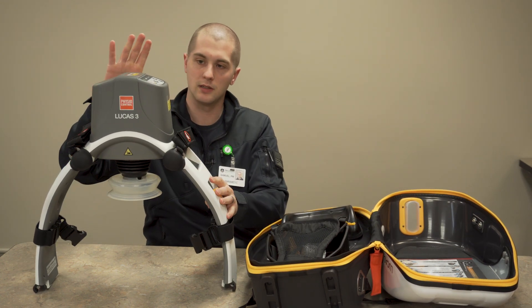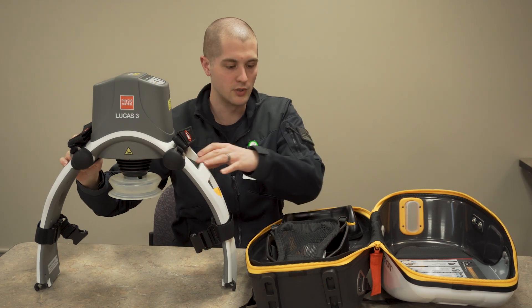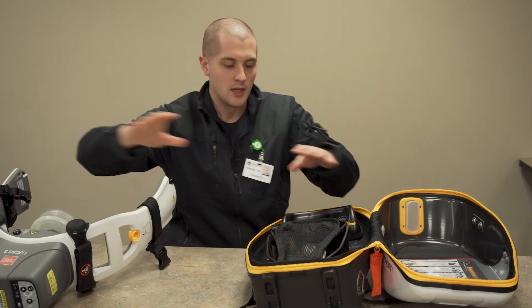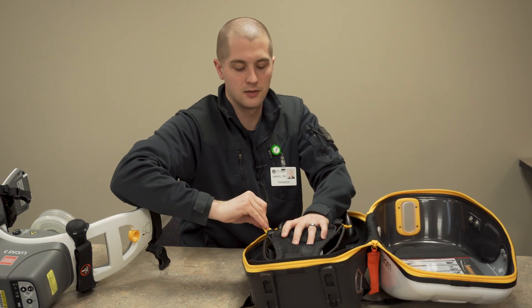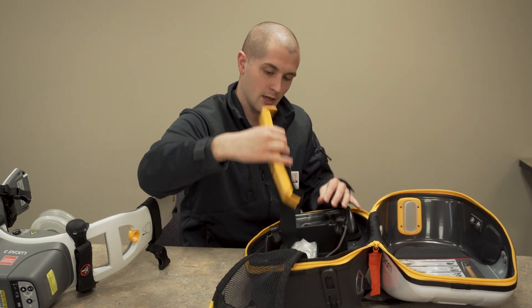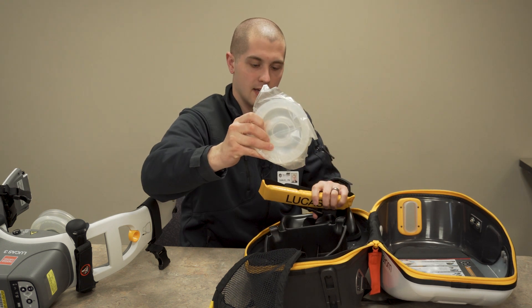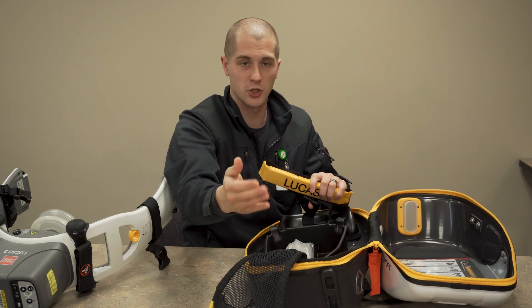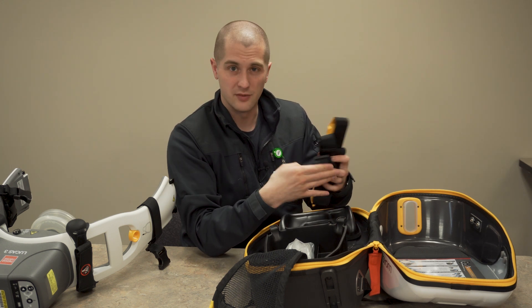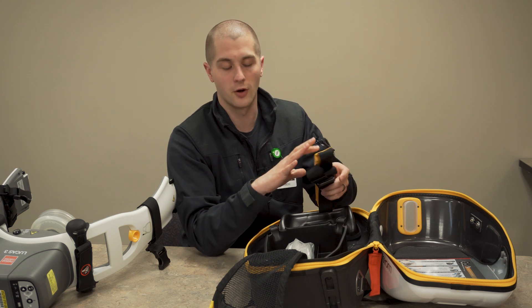The Lucas 3 system has several different things on it, a lot of different buttons, and we'll go through these one by one. In the rest of the case, you have a pocket. For us, this will generally carry the head securing strap and a suction cup as well as charging cables. You can fit an extra battery in this case; however, we've opted not to do that as we have extra battery chargers on our ambulances.